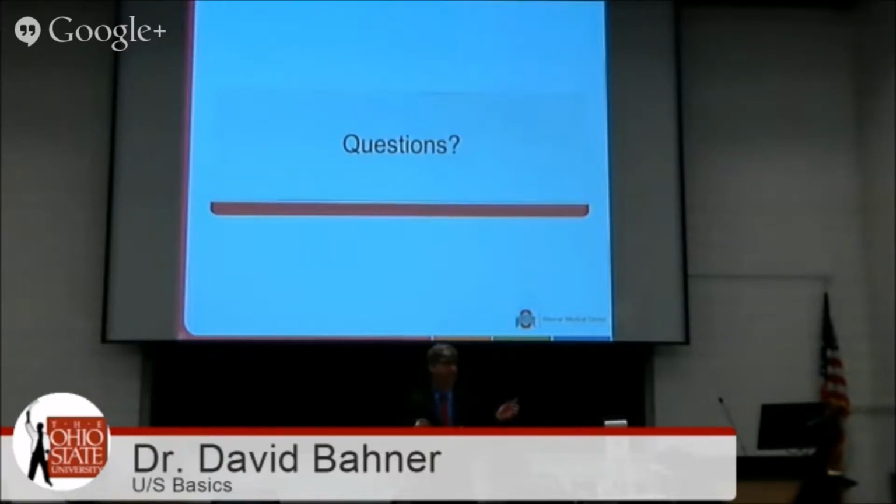If something's not centered, I want it centered. If I move in this direction at 90 degrees, what do we call that? Sweep. If I change the angle of incidence, that's a fan, and then we're going to rotate. Just so we can communicate when we're going to do that.